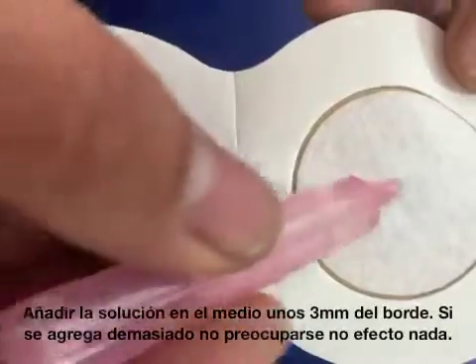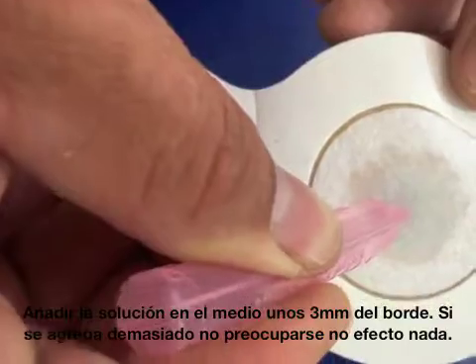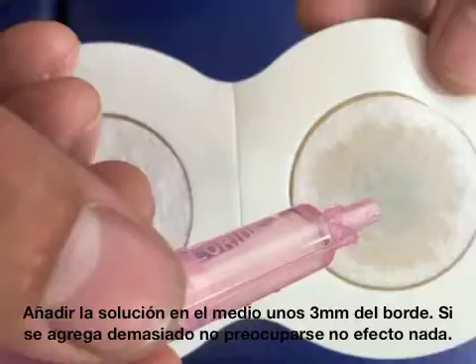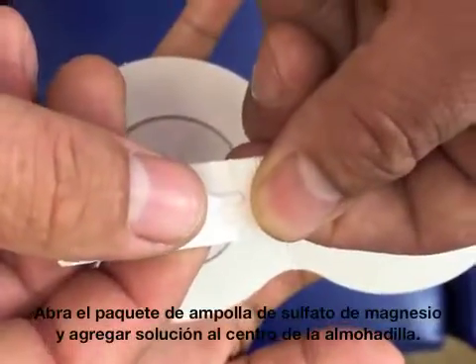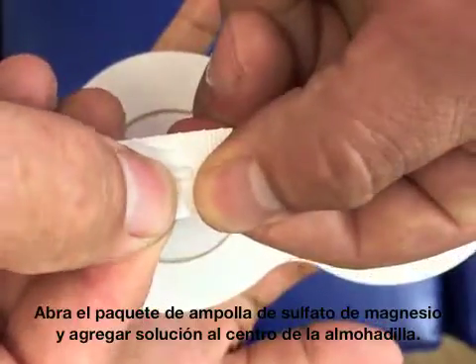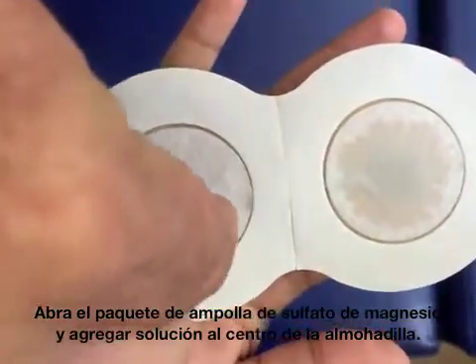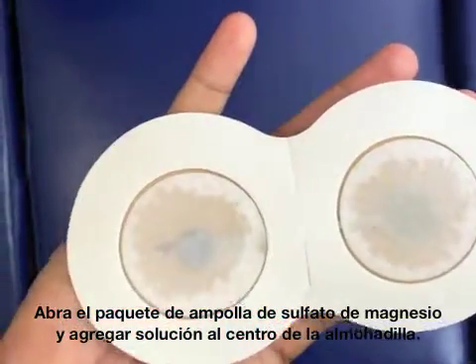You want to get the solution towards the middle, about 3mm away from the edge. If you get a little too much, don't worry about it — it's not going to affect anything. With the magnesium sulfate, you just tear open the blister, put it on the middle of the pad, and you're all set.